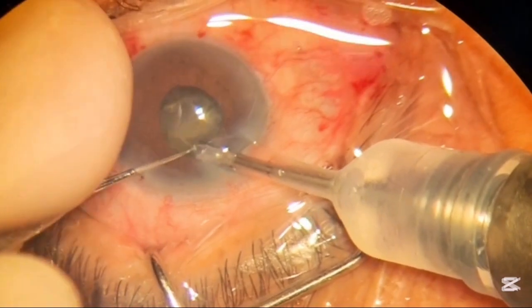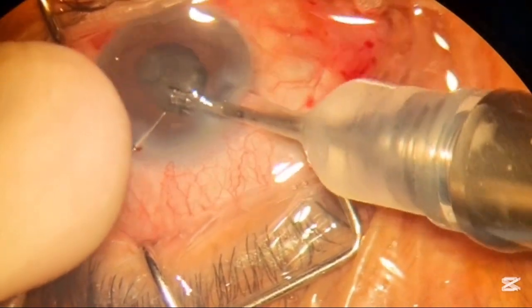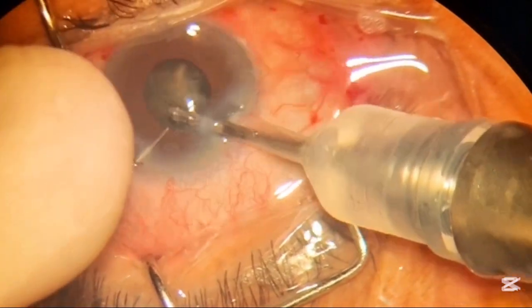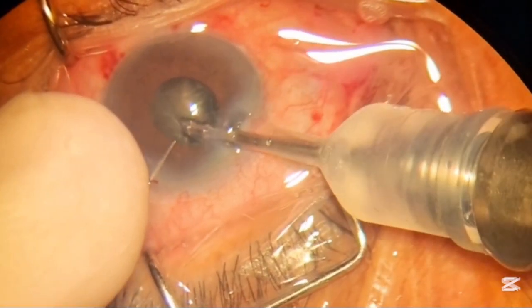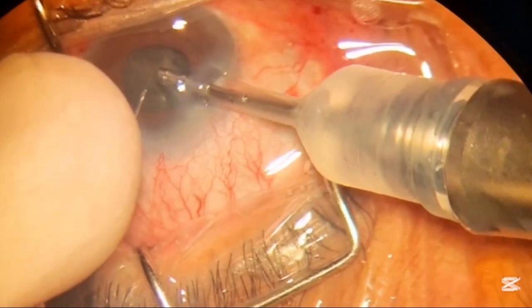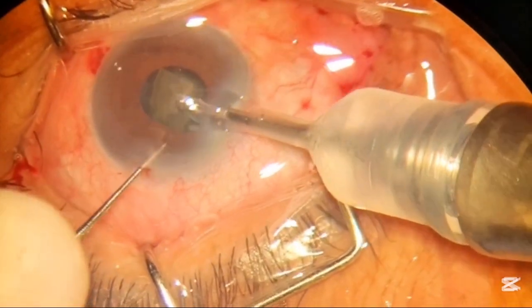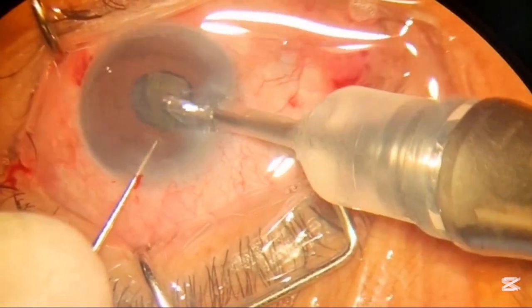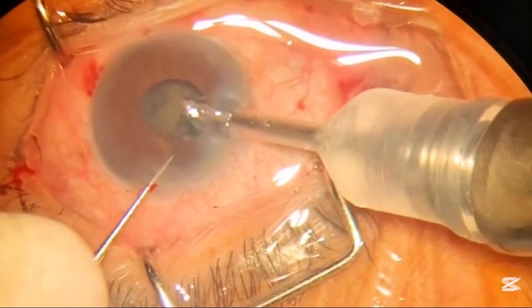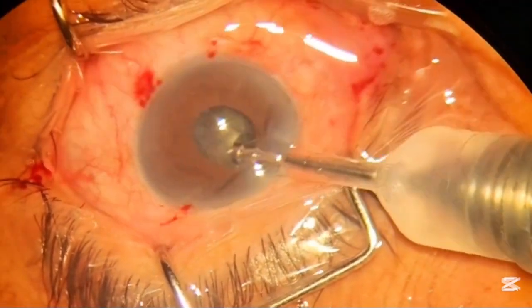Now we are almost done with all the pieces — this is the last piece to be removed from the capsule. The mechanism of phaco emulsification is: touch, hold, and emulsify. In this mechanism, all the control is governed by the position of the pedal, which is operated by your foot.